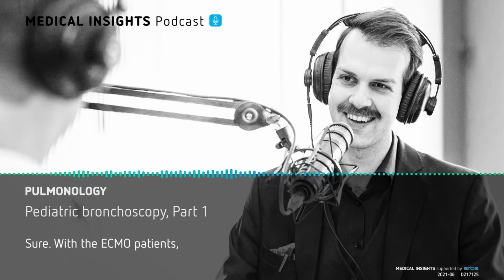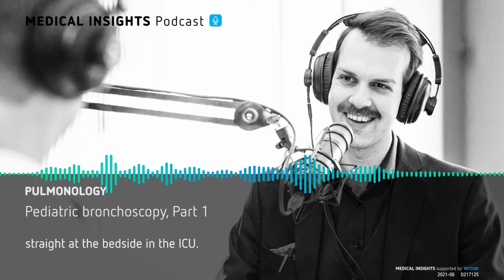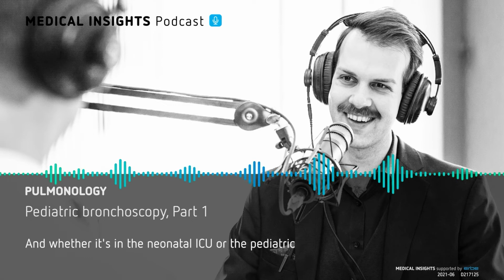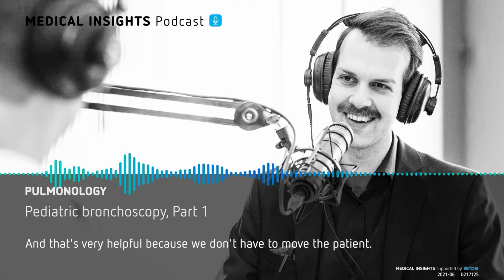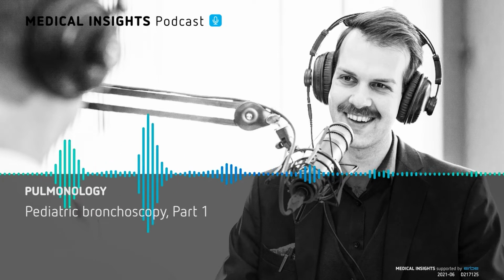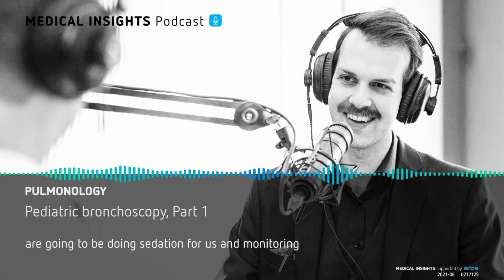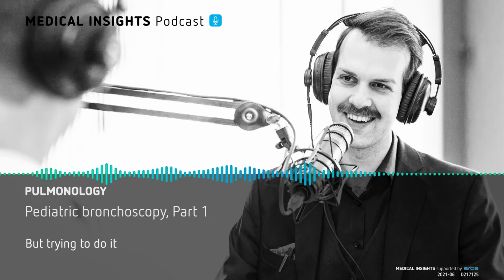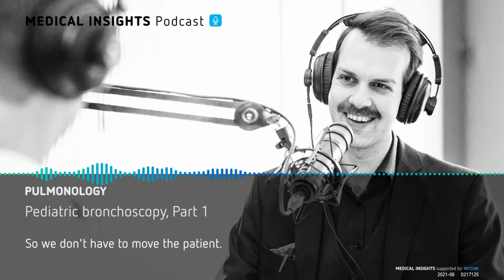With the ECMO patients, one of the nice things with being able to do bronchoscopy is we can do this straight at the bedside in the ICU. And whether it's in the neonatal ICU or the pediatric ICU or the cardiac ICU, we can do it at the bedside. And that's very helpful because we don't have to move the patient. When we're doing that, our ICU colleagues are going to be doing sedation for us and monitoring the stability of the patient while we're doing procedural work. But trying to do it in the ICU for the ECMO patients is my preference, so we don't have to move the patient.